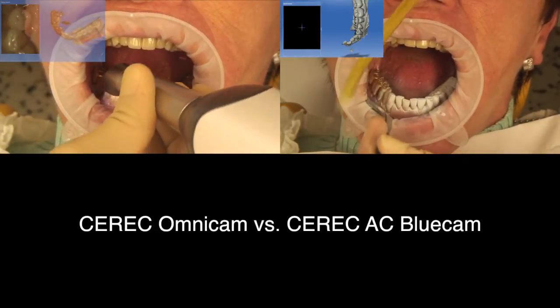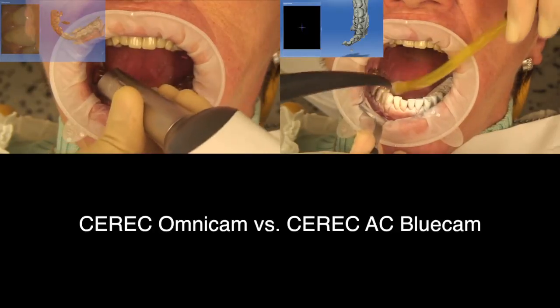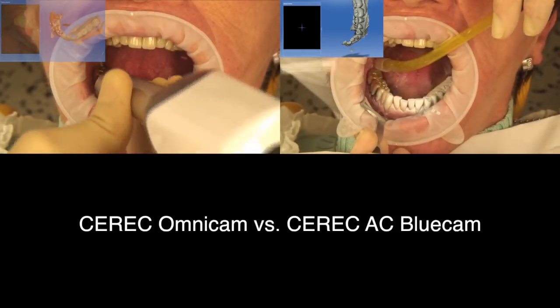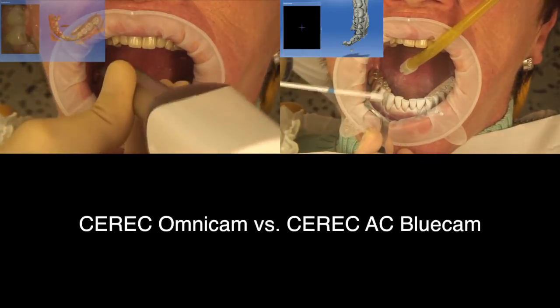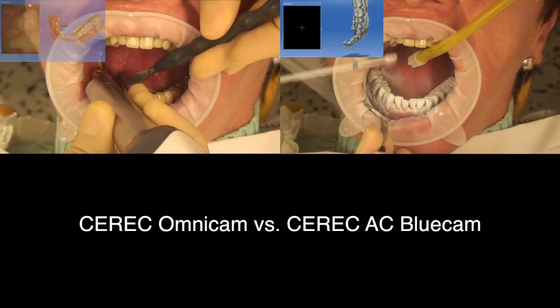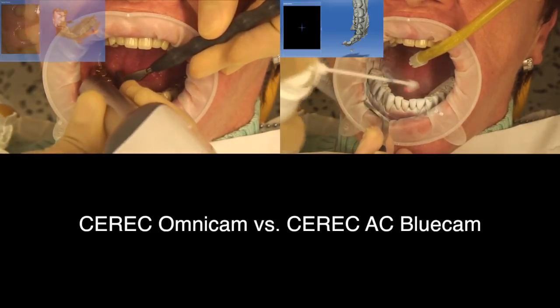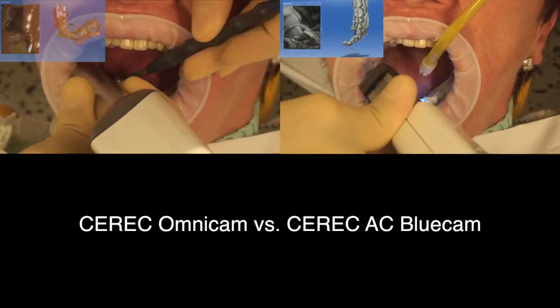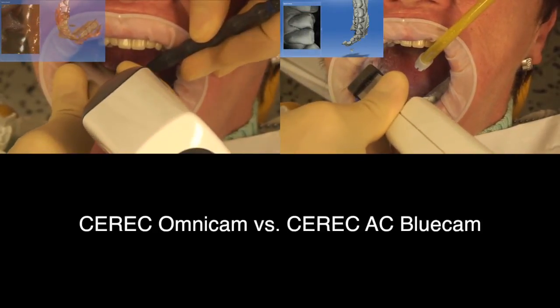The Omnicam takes a series of individual images with the continuous video stream. If it loses the thread, there's an audible and visual signal to alert you. If this happens, you'll need to scan in an area it already knows so that the model can carry on being built up. With the Bluecam, there's also a visual signal.